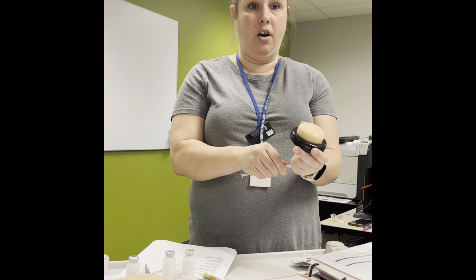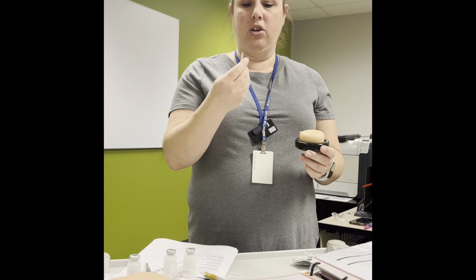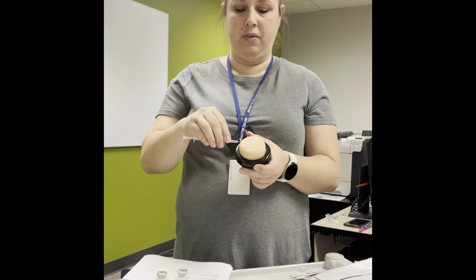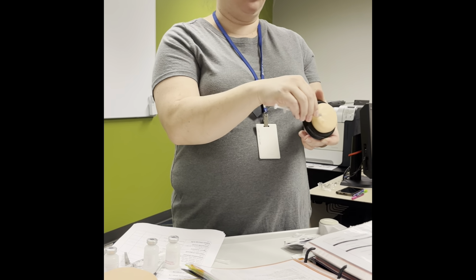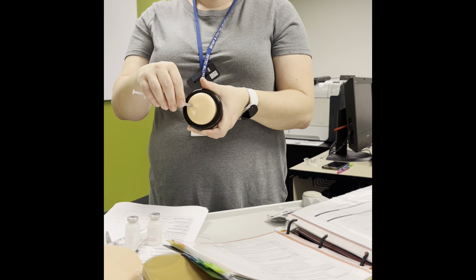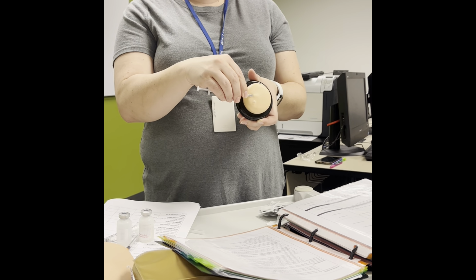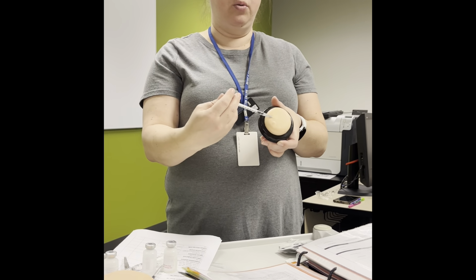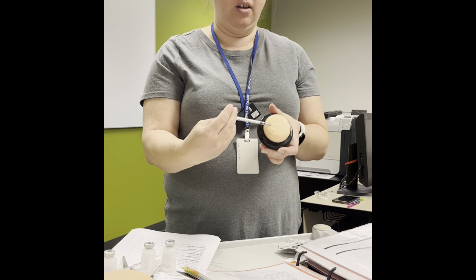So I'm gonna take off my needle. I'm gonna look to see where the hole or the bevel is up. I'm gonna go at a 5 to 15 degree angle, and I'm gonna insert the whole thing into there. And you can almost kind of see the needle coming through the pad. I am then going to slowly inject.